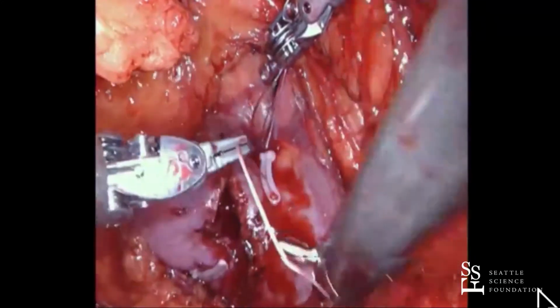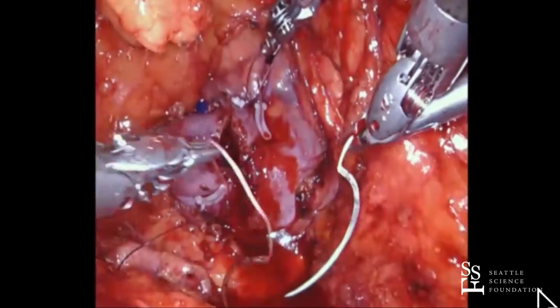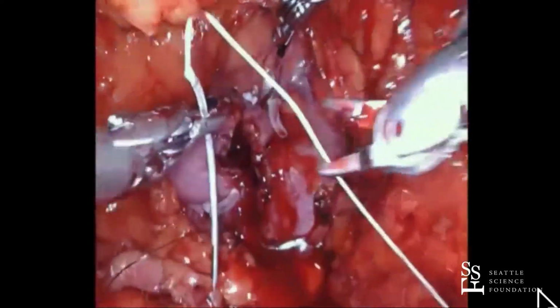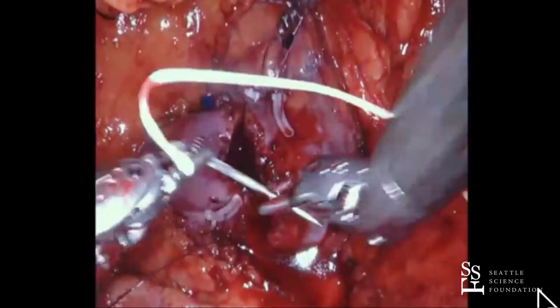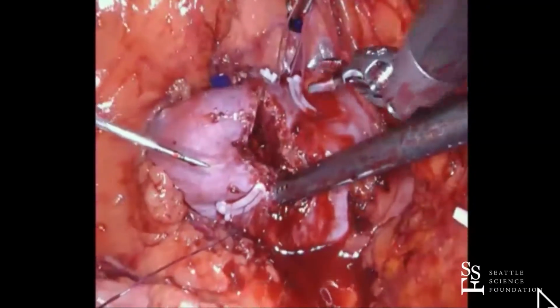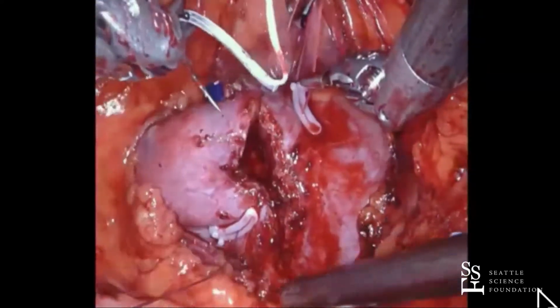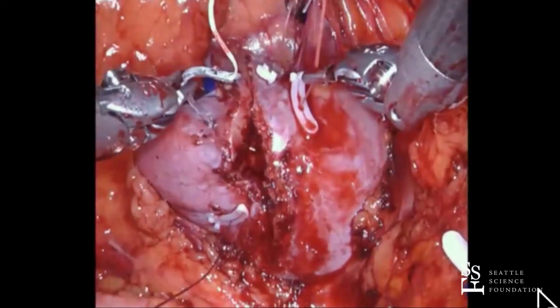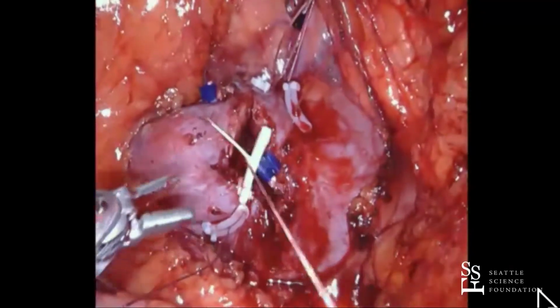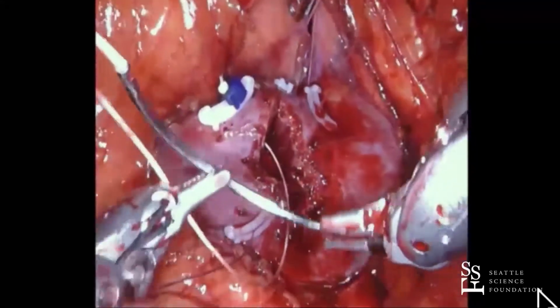Question is, any role for hemostatic agents at this point, Jim? No, I don't think they do anything. Well, first of all, they do something, but I don't think they're going to stop the kind of bleeding you're worried about, which is arterial bleeding. I think they're good for cortical ooze, but other than that, I don't think they're going to do much. Yeah, I agree with you, except that before I do this, I put a little layer of Floseal in there because it'll stop the cortical oozing. So it'll compress, you'll close it.